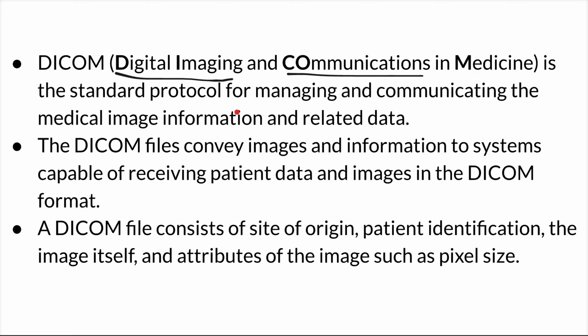Okay, so DICOM files convey images and information to systems capable of receiving patient data and images in a DICOM format.